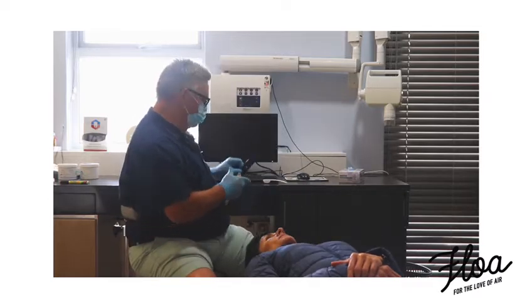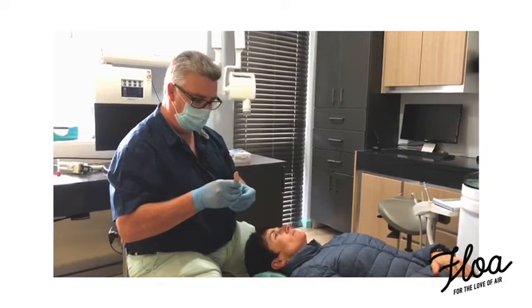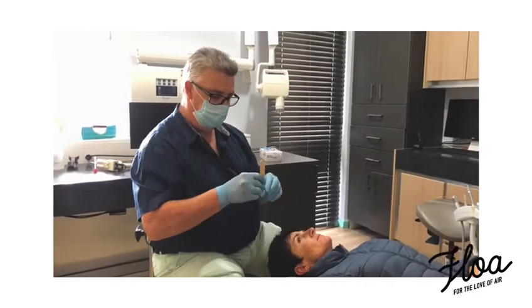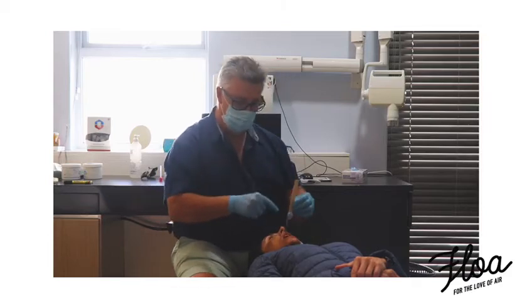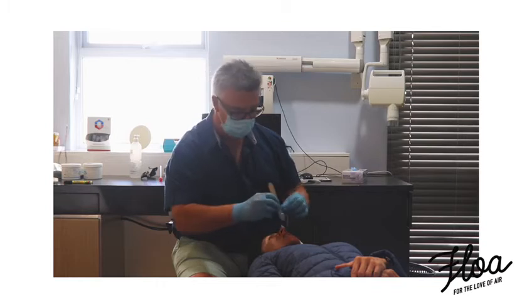Let's mix up some putty. The reason for the putty is to get a lock position and a stop for the mandible. The reason why I put that lock position on the mandible rather than on the maxilla is it's easier for me to move things around and mark them than trying to work from the bottom.